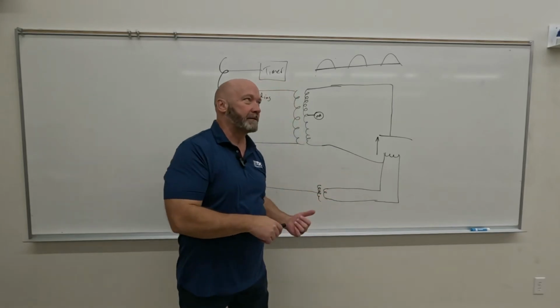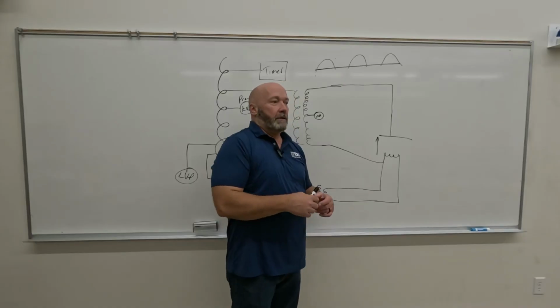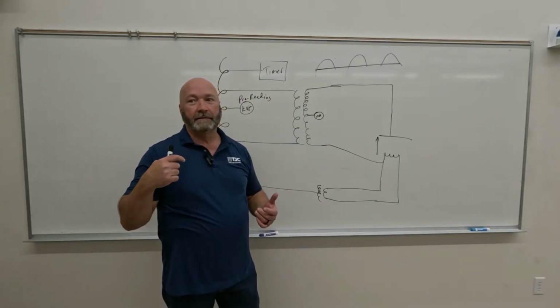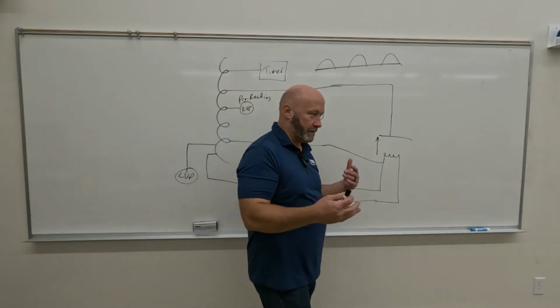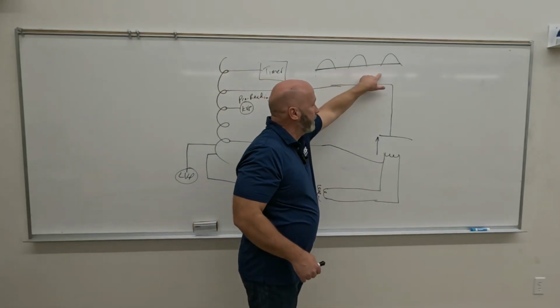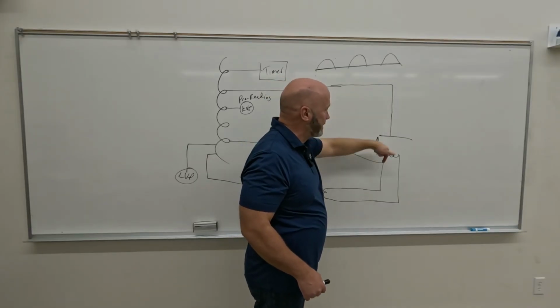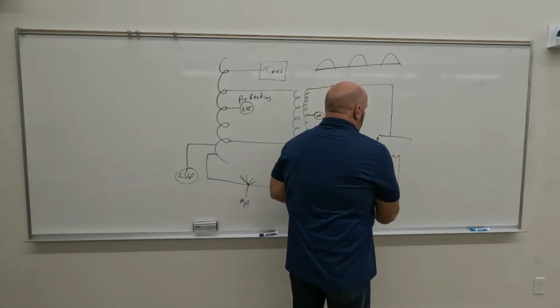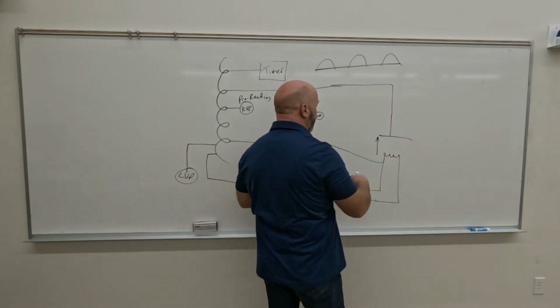So now we're going back to the chapter before, where we were talking about electricity. We had conductors and superconductors, and we had semiconductors, right? So semiconductors, what's going to do that? Let's start with this. Let's say we want this waveform, but we're using kVp high enough that we could send electrons back across the X-ray tube. So we've got electrons going that way, but we want to prevent them from coming this way.